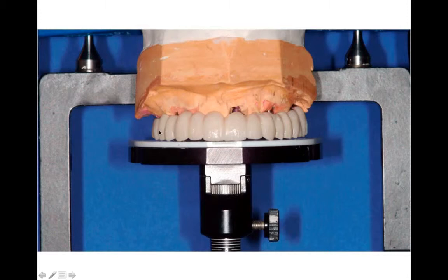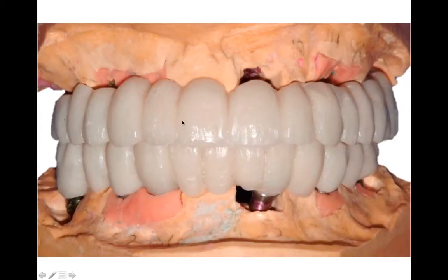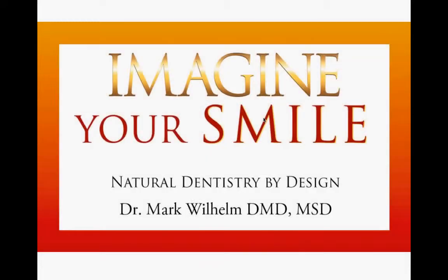And then this is John's facial analyzer, and then from the face bow, the case is designed. We have our incisal edge where we want it, and all the teeth are on this plane, and the lower is built to the upper. The patient has a new set of provisionals that meet the aesthetic requirements we want, and the occlusion is good, and then from there you can go on to complete your case.